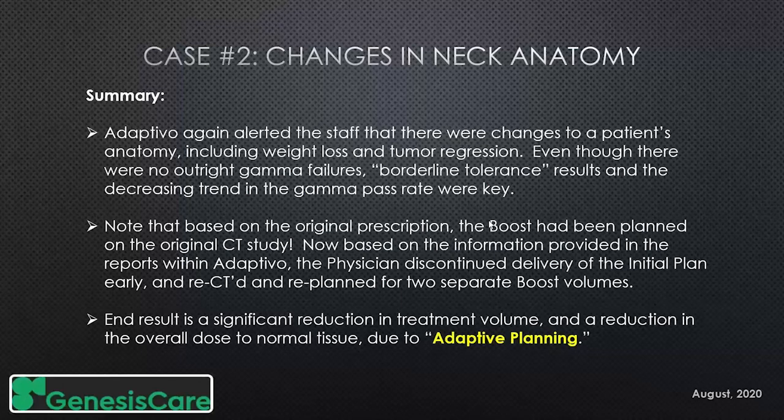I see another question. It says, is daily dose calculated with cone beam CT directly? Any deformable image registration to correct the Hounsfield unit? This is probably a question Mary can answer. I believe that is being considered in possibly a future update. There is an additional mode that is supposed to be in addition to our relative mode and our predicted mode. It's like a true adaptive mode, but I don't know what the status is. Mary might be able to answer that question.